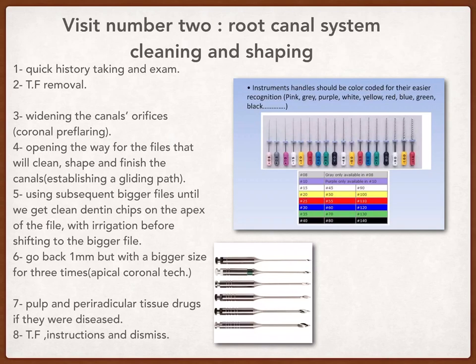Of course, between and before shifting to the next file, we should do the irrigation. Guys, the irrigation is the most important step in the root canal treatment procedure for me, because during my practice I have seen that the access is very important for you, for your back, for your muscles, because it will facilitate the work.